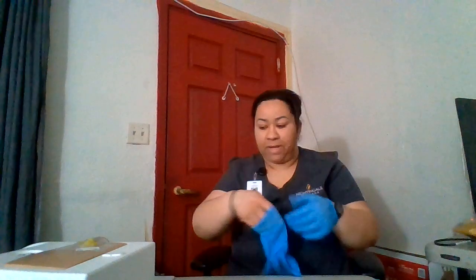I will be performing the skills video for IV fluids and medication administration. I will first perform hand hygiene. I will be putting on my gloves. In this scenario, the doctor has ordered IV fluids to be administered at 150 mLs per hour, and he has also ordered amoxicillin to be administered 100 mLs in 15 minutes.